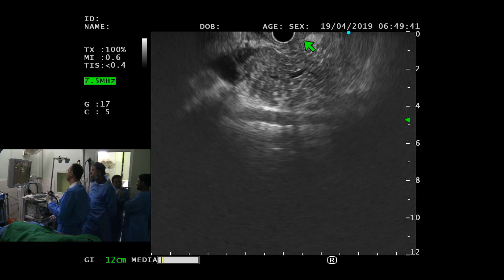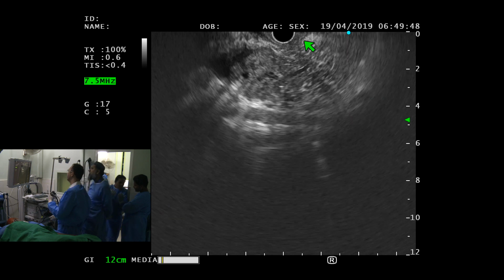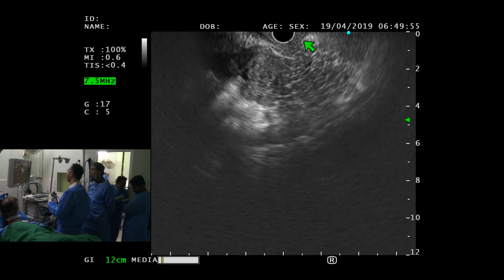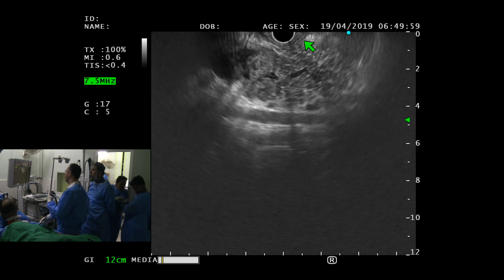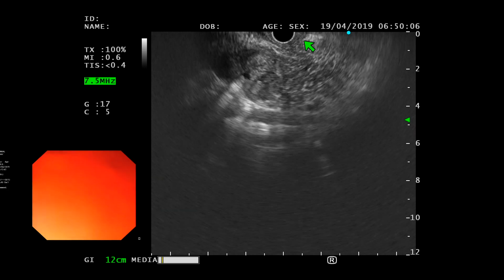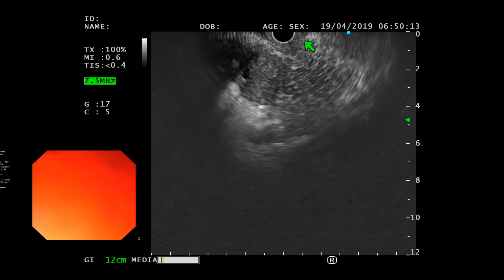So I agree with you. But a lot of oncologists would want a biopsy and they would say go back and get an FNA done, have some tissue, and we can treat and work on it. So the patient comes back to you saying, I've seen an oncologist, maybe an MDT, and they said, okay, go and get an FNA. So he comes back and you end up doing two procedures, number one. Number two, the disadvantage of doing an FNA, really, do you think there is a disadvantage apart from cost and needle?